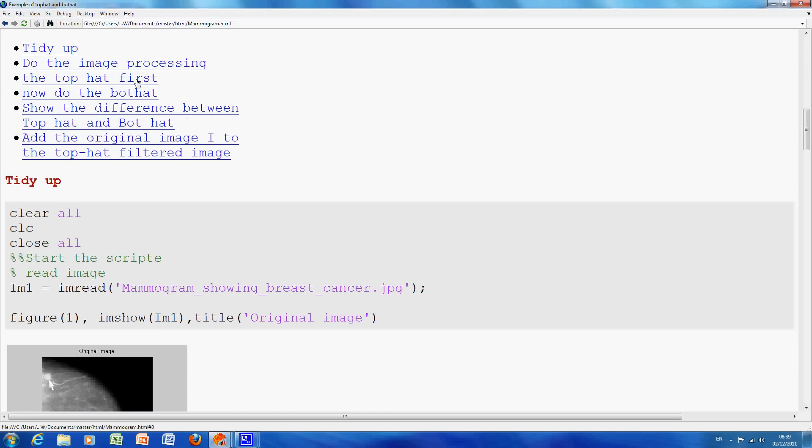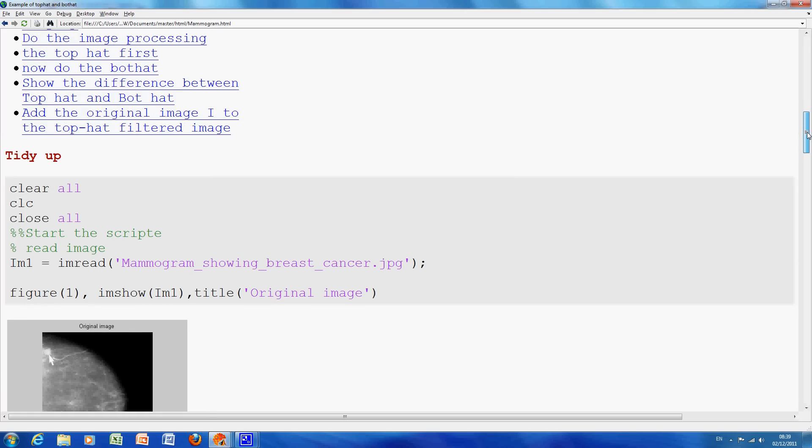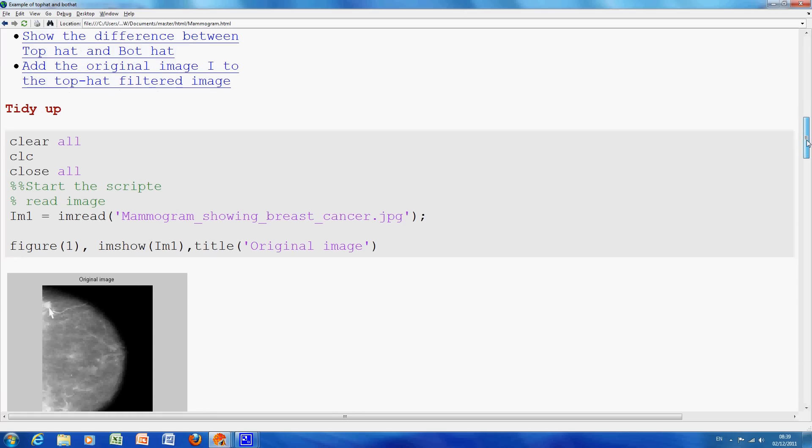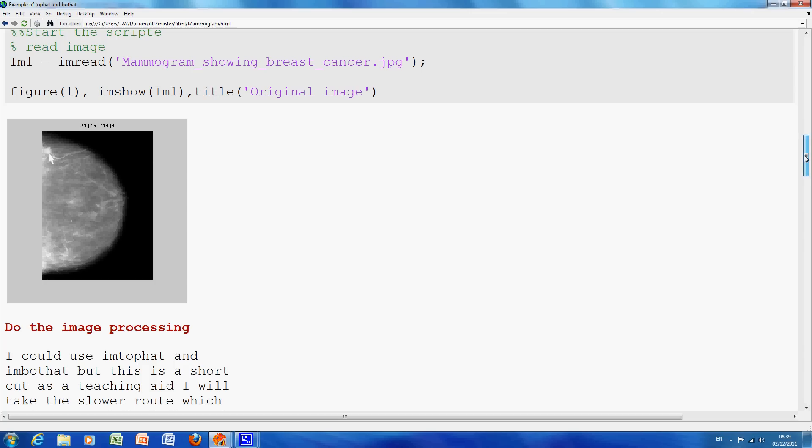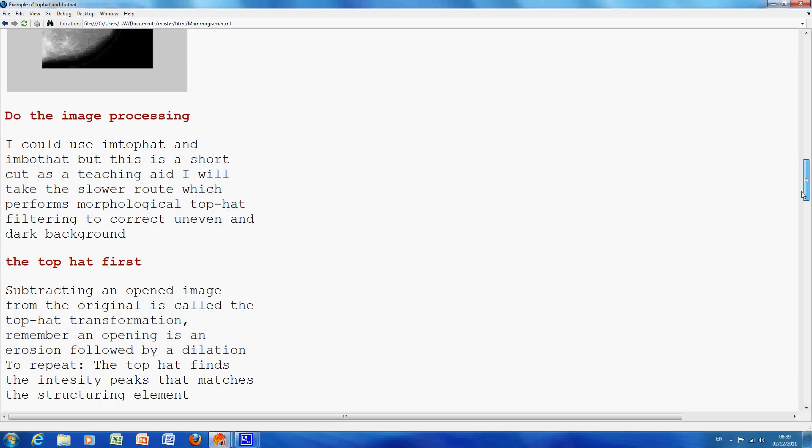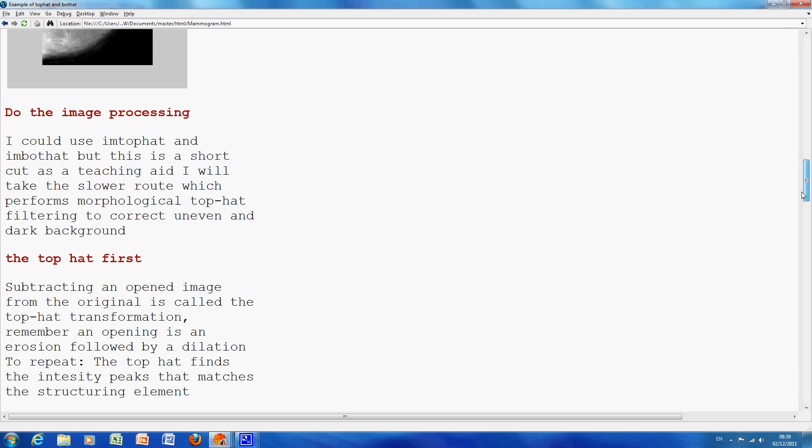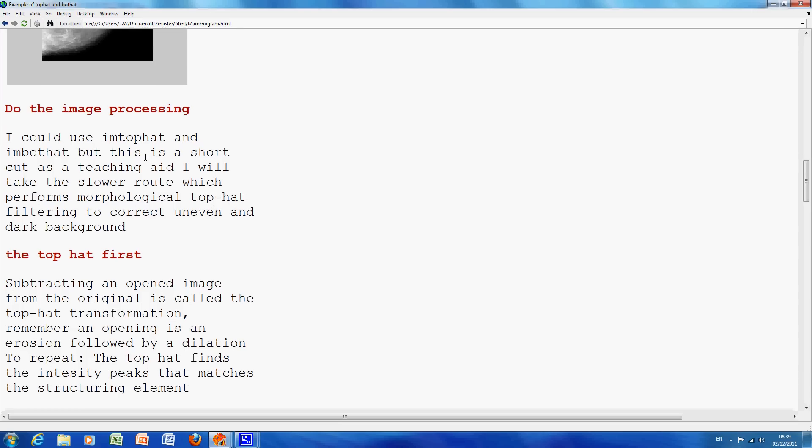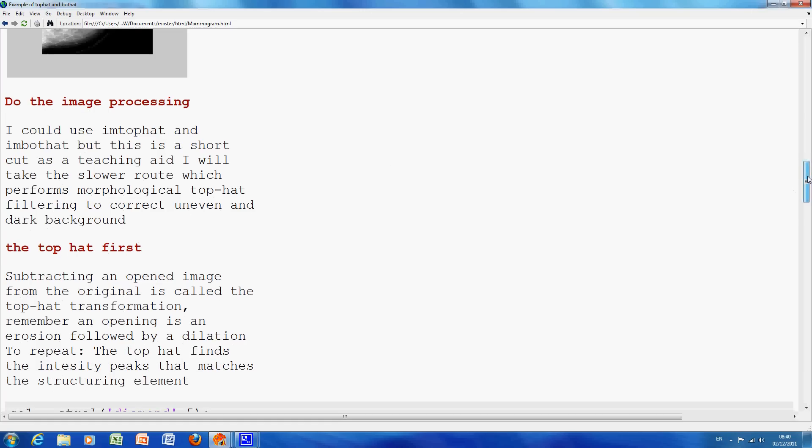So, we've generated a table of contents here, we've started as before, you know this by now, clear the workspace, clear the screen, close all figures. We read in the mammogram, we show the mammogram here. And I could use IM TopHat and IM BotHat, the function, and they do that in MATLAB itself, but I want to try and explain it a little more clearly.